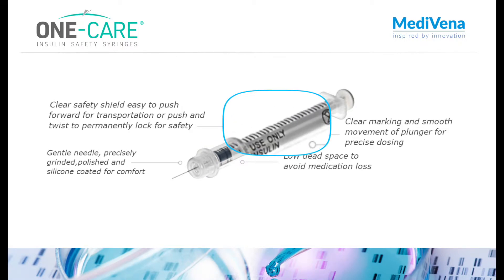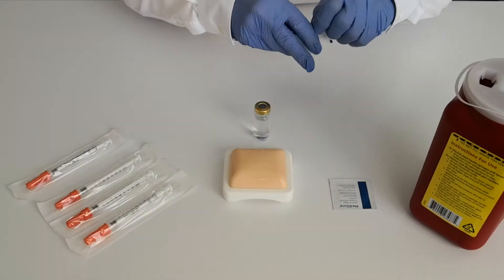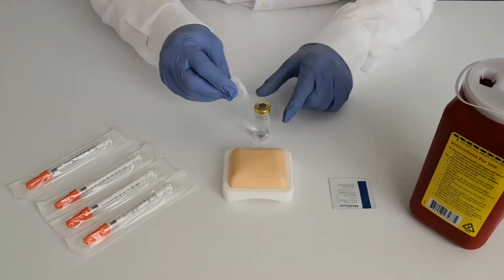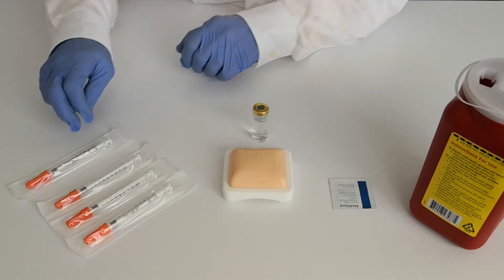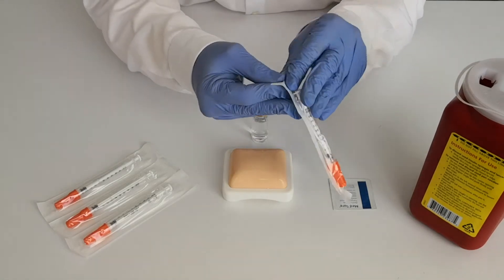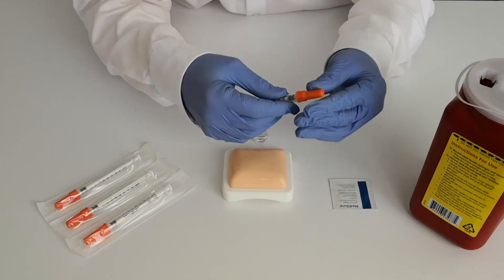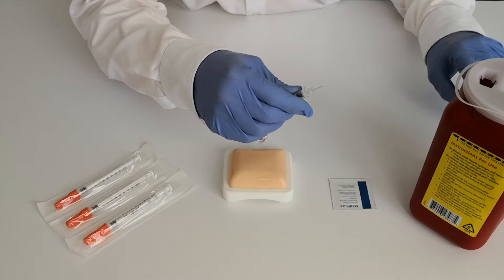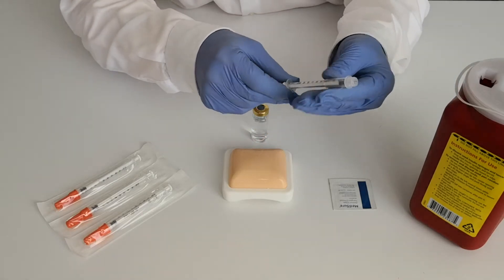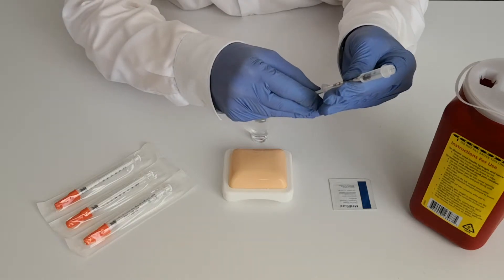Has clear markings and smooth movement of plunger for precise dosing with low dead space to avoid medication loss. To begin, cleanse the vial. Remove the syringe from the blister pack. Then take off the color-coded protective cap. Follow your institution's guidelines to draw up the medication.